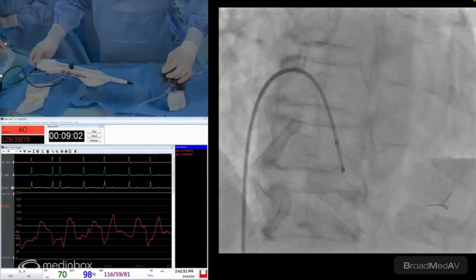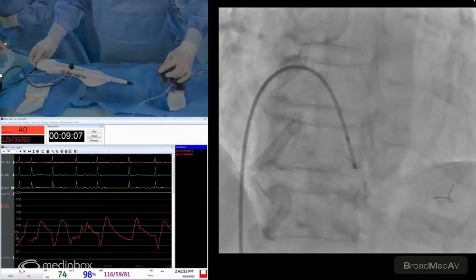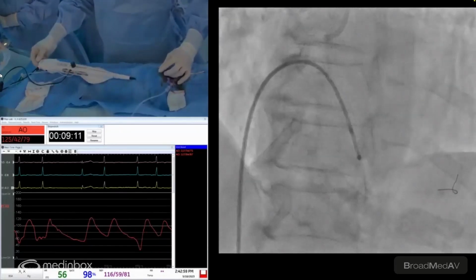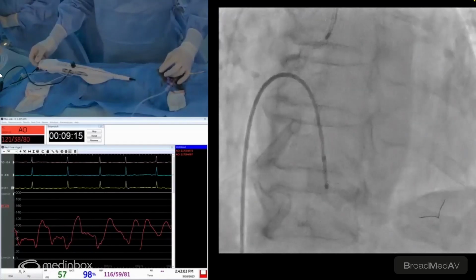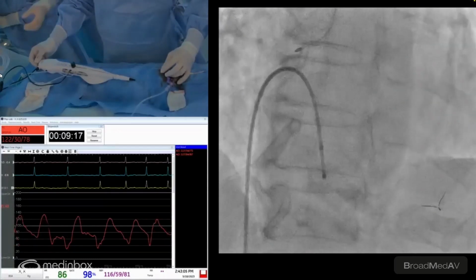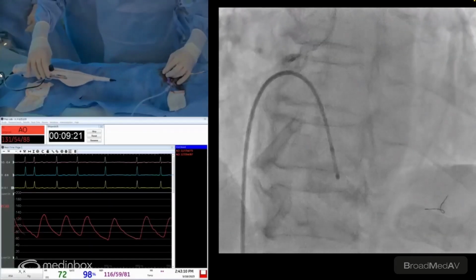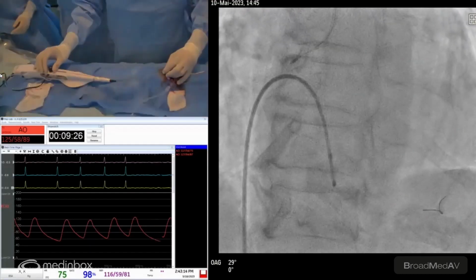Here I'm dealing with a long lesion, so I want to make sure I really take it slow, because this is the type of lesion where you can run into entrapment. If it goes too quickly, then you get entrapped. So I'm going to demonstrate the technique. I'm here at the guiding catheter, 2 centimeters to avoid the jump. And then you put everything straight, release the tension. So I pull back a little bit.